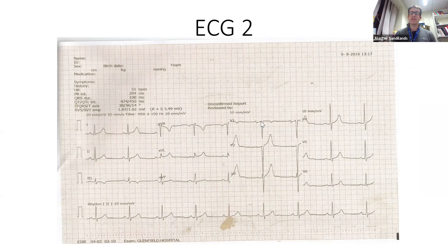Now we come to the R wave. The R wave is very small in V1, very small in V2, small but getting bigger in V3, but then suddenly jumps to V4 being very positive. So that's probably okay. If you put an ECG lead between V3 and V4 and called it V3.5, you'd probably find the transition complex. Does anyone understand that? You've got a jump here between V3, where the R wave's getting bigger but is mostly negative, and V4, which is very positive. So it's probably between V3 and V4, so the R wave's probably okay.